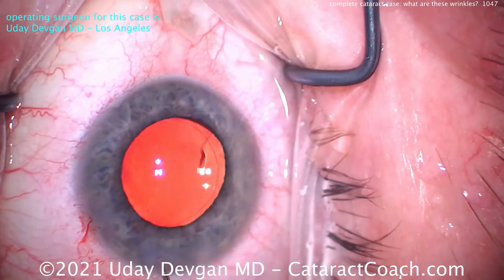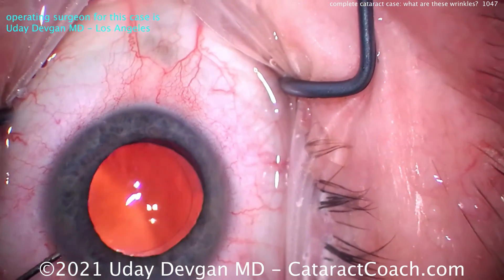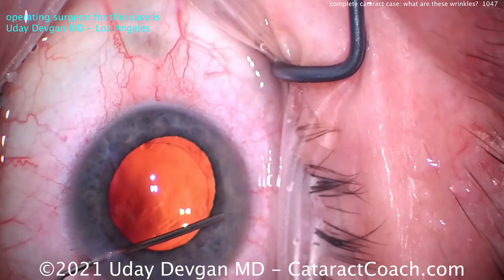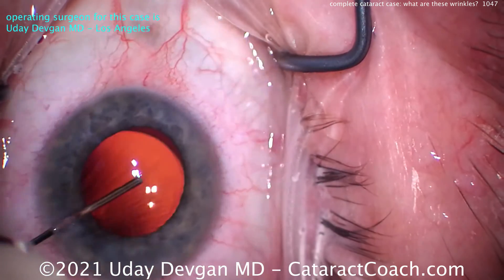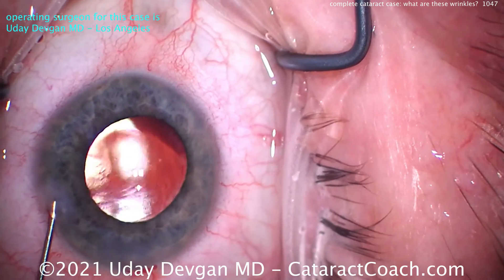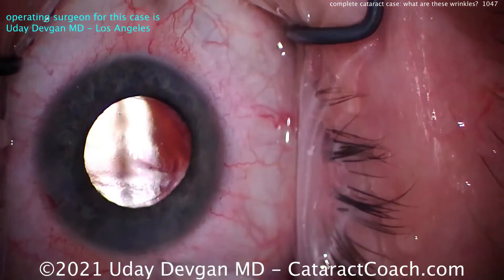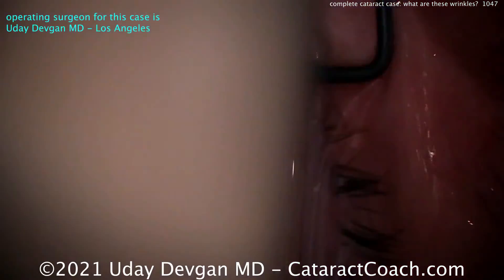Let's seal up the incision. Is there any viscoelastic left? We'll find out — we'll do a little angle sweep, back and forth, sealing up that incision. Looking pretty good. Let's go in through the side port to do a little inflation as well as angle sweep — centering the lens, sweeping the angle. Just a tiny bit of viscoelastic is being washed out of the eye. I depress the paracentesis a little bit as I do that to give a port for egress of the fluid. Injecting inside the eye Miochol and tetracaine to give that osmotic gradient. Seal up the incision — bam, we are done. Nice case.